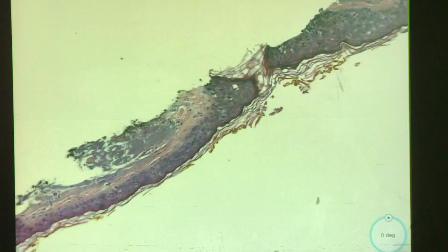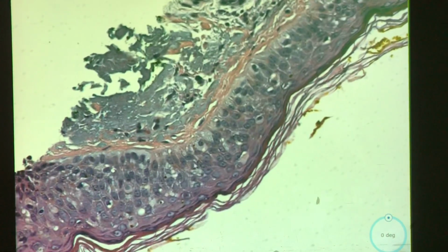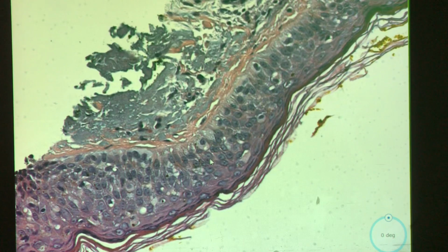This is melanoma in situ. Although it's hard to tell, these cells don't look normal, but they kind of run together. Remember, we have a very low threshold in dermatopathology for calling something too much atypia. The atypical cells you're seeing are all melanocytes, and they're at all levels.